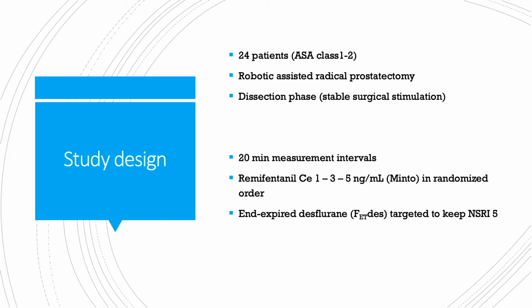In these intervals, we gave a specific combination of remifentanil and desflurane. Each patient received a remifentanil effect site concentration of 1, 3, and 5 nanograms per milliliter in a variable order. We adjusted the end-tidal desflurane concentration to keep a stable NSRI, noxious stimulus response index, of 5.